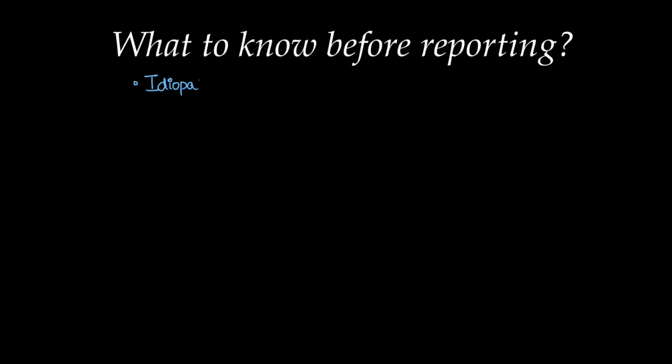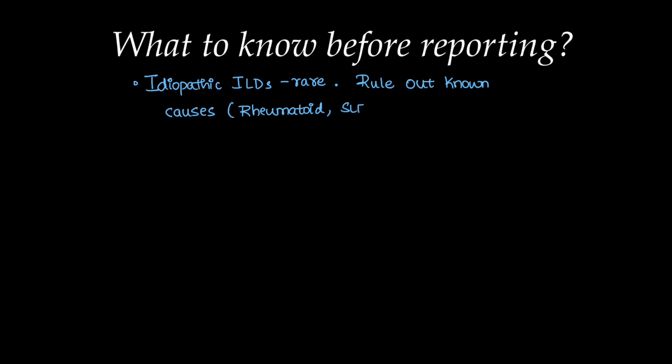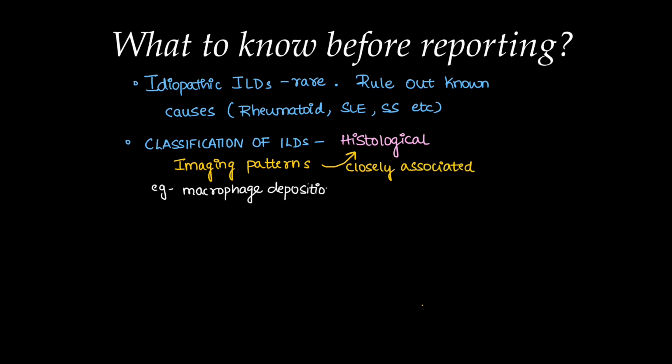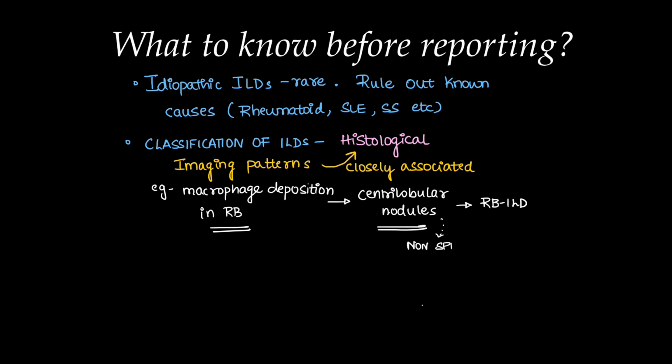Here are some key points to know before reporting cases of ILDs on HRCT. Idiopathic interstitial lung diseases are rare, so rule out the known causes like rheumatoid arthritis, SLE, systemic sclerosis, etc. Classification of ILDs is based on histology, not imaging. The imaging patterns are just closely associated with histological findings, like macrophage deposition in RB is a pathology. Centrilobular nodules appear on imaging, seen in respiratory bronchiolitis. Just centrilobular nodules are non-specific, so correlate with histology.